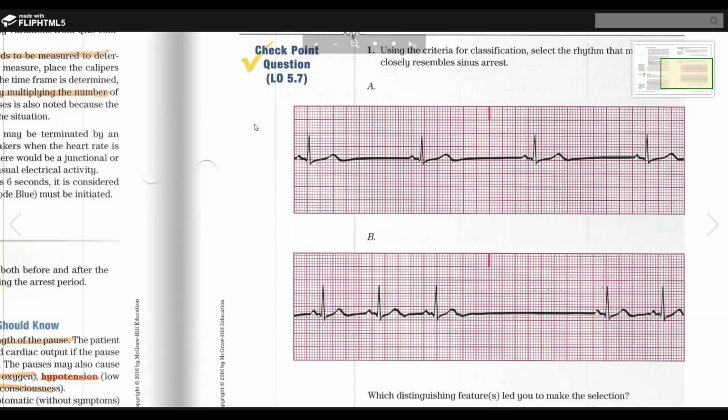You said you did 13 times 0.02, but 1 little square is 0.04. ¿Qué?